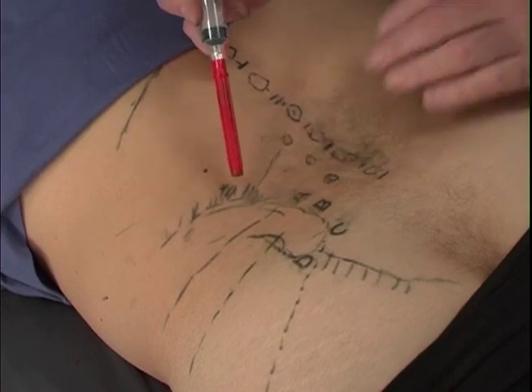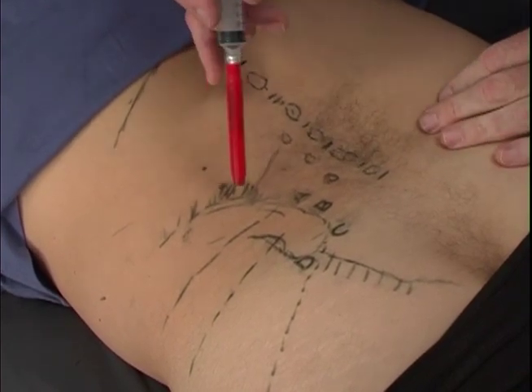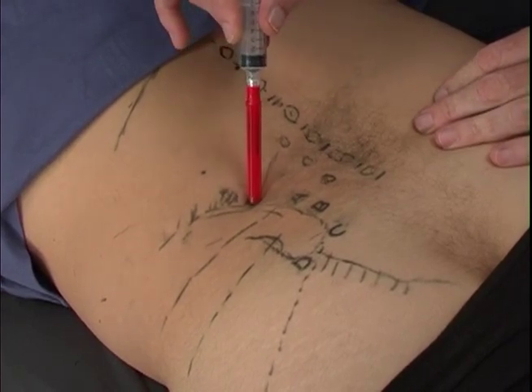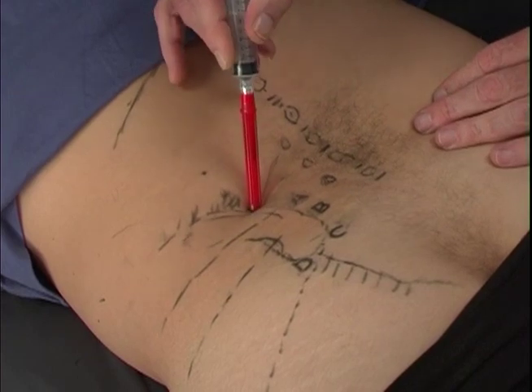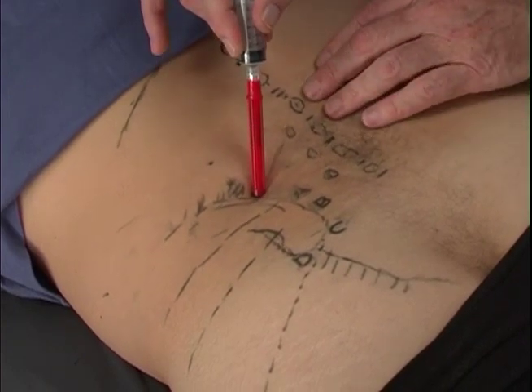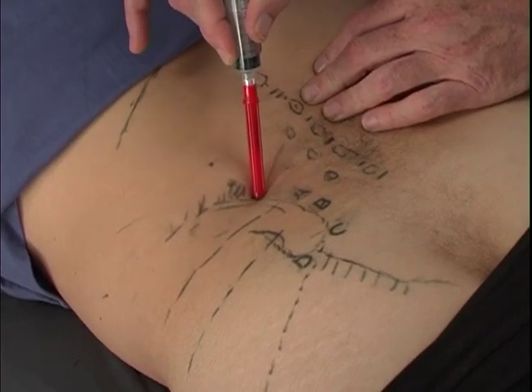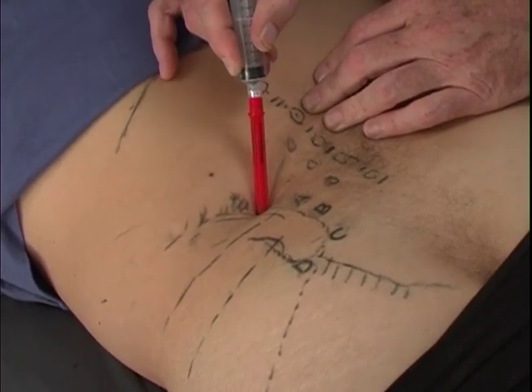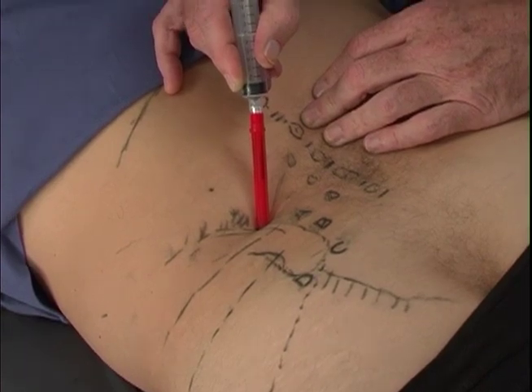This can be accomplished in a couple of different ways. One is to come into the ilium itself, touch the bone, and then slide your needle off of the bone and underneath the ilium, curving the needle under until you hit the bone deeply underneath it.